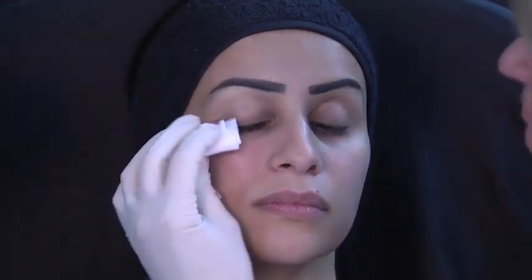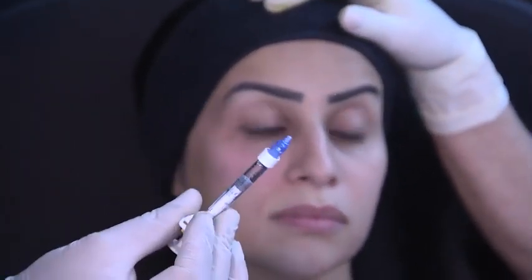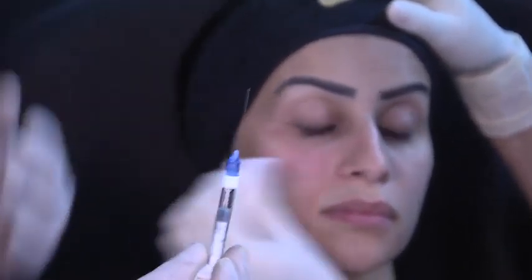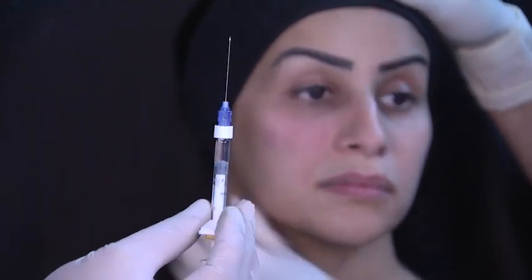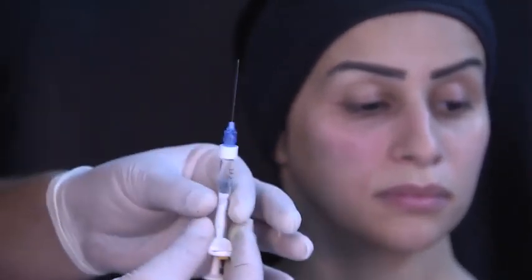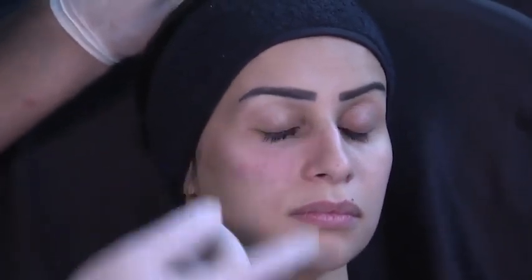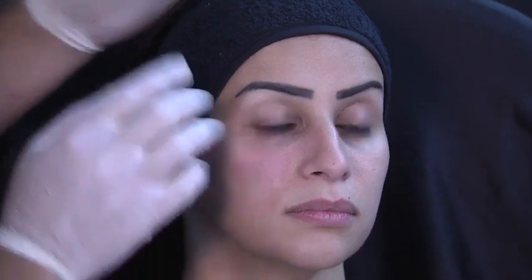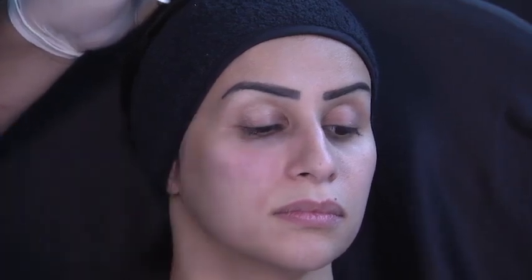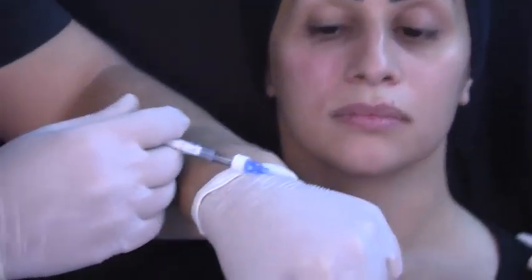Right. And is the amount of Vital Light under the eyes consistent or does it depend on the patient's needs? So look, I have used, if you see this on the camera, a total of 0.6 of Vital Light for this correction. I could have used 0.5, because remember that in our clinics sometimes we have to spare a little bit of product for the other side, but it's not much, and this is a product of 12 milligrams per milliliter. The amazing thing is that if I palpate now the skin of my patient, I don't palpate any nodule, any product. And remember, this is a skin booster. It will also improve the very fine wrinkles that some patients have in this area. That's a very valid point.